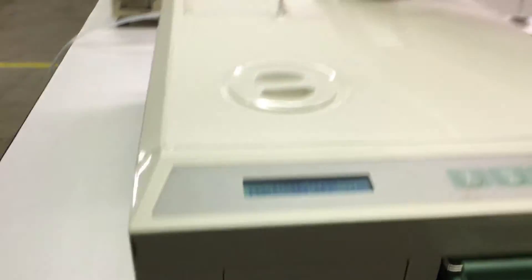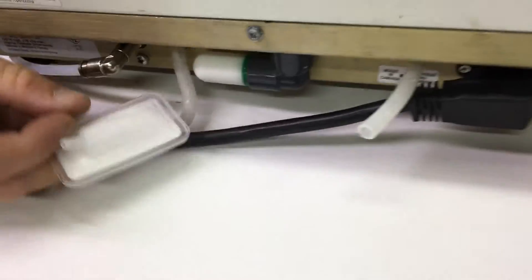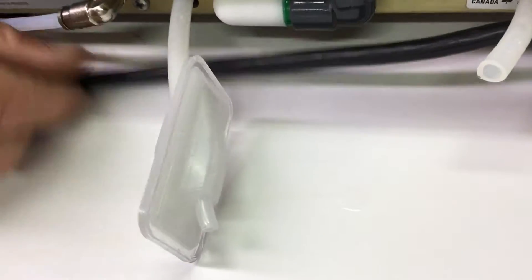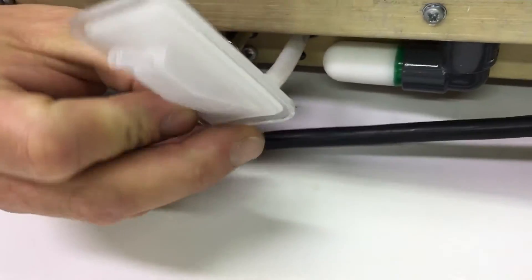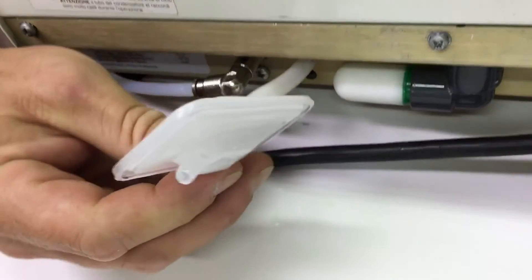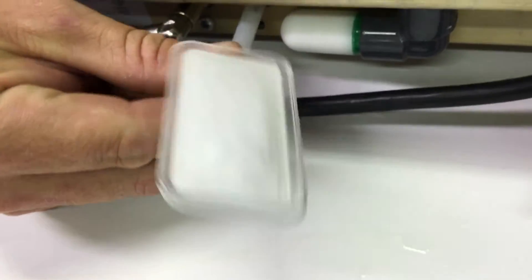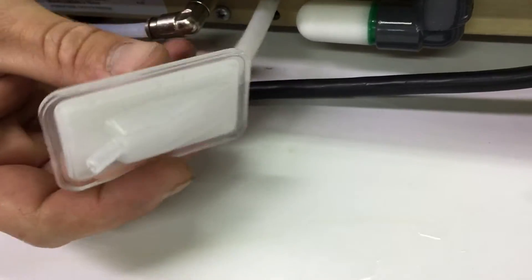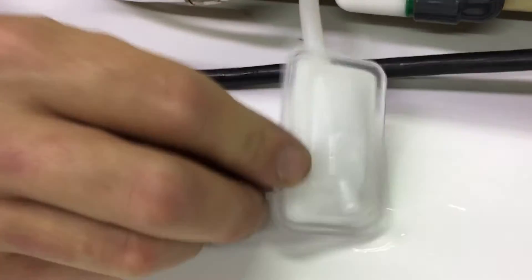But if we go around to the back of the machine, we can see that the air filter, it's a milky white color and it's leaking water and steam. There's water inside of this. This filter should look like this.